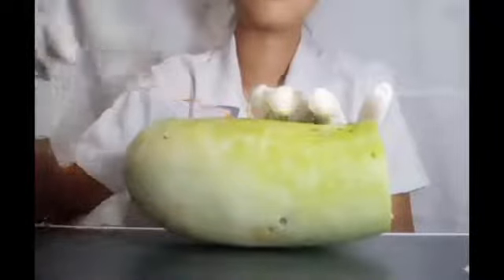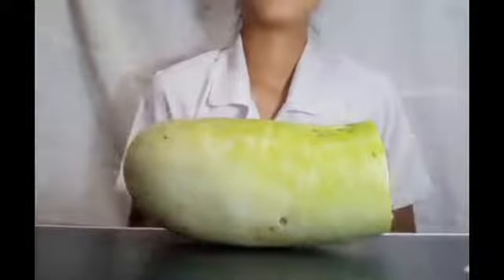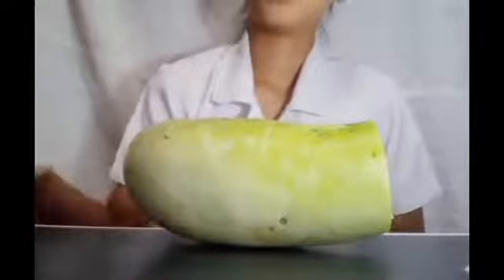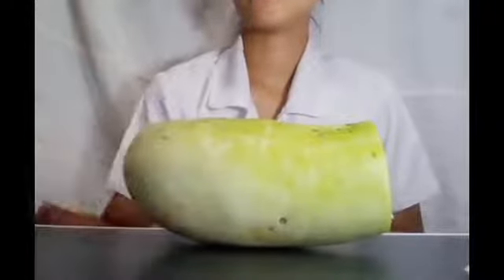There you go. This needs to be read within 48 to 72 hours. And of course, we're going to dispose of this in the sharps.